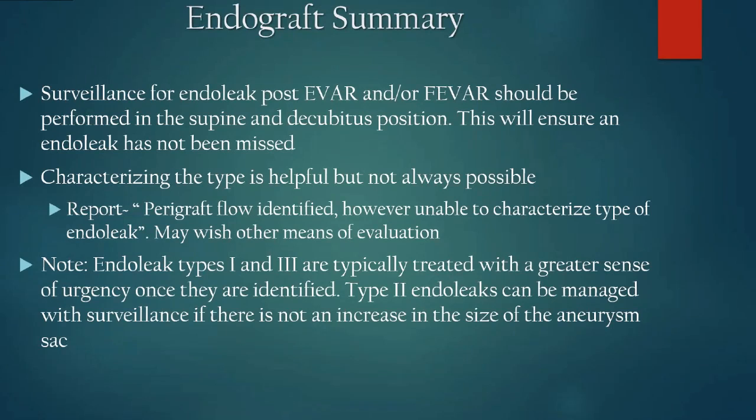So in summary, surveillance of endografts post-EVAR or FEVAR should be performed in the supine and decubitus position. This will ensure that endoleaks have not been missed. Again, characterizing the type of endoleak is helpful, but not always possible. And you just report that, like we said, unable to characterize type of endoleak, may wish other means of evaluation. Like we mentioned, type 1 and type 3s are typically treated with a greater sense of urgency. Type 2s can be monitored and managed if there is not an increase in the aneurysm sac size.